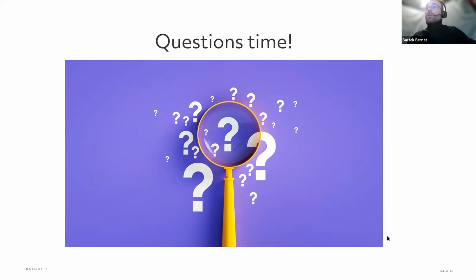Good. So if there are no questions, I hope you enjoyed this little presentation about TRIOS possibilities. There's way more to cover, of course. So you are very welcome to the second part, where I'm going to cover more sophisticated scans, like implant scanning, and also some things about the application that you have in your Dental Desktop TRIOS system you could use to enhance or excite your patient experience in your clinic. So this is more or less all I have for you today.